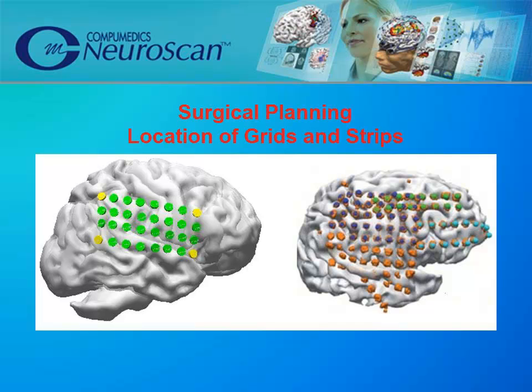Often the next step in clinical evaluation is to decide where to place cortical grids and strips. In this case, on the left, a 4x8 grid was placed. Additional grids and strips may be placed as well, as shown on the right. Labels are user defined, and the results can be saved in convenient formats or printed.